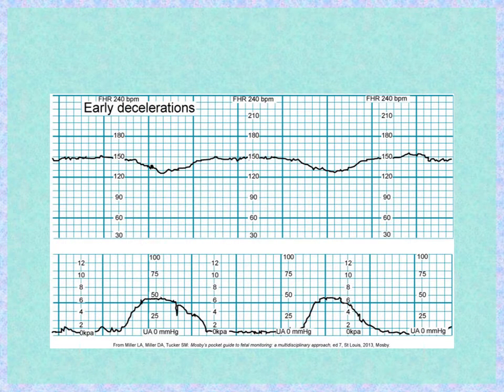Early decelerations. This also shows early decelerations. The same thing. You see the deceleration go down with the contraction. Looks very similar. Looks like a mirror image of the contractions below.